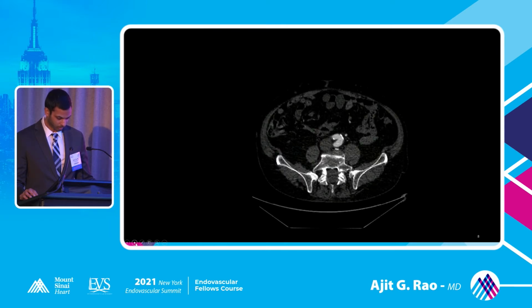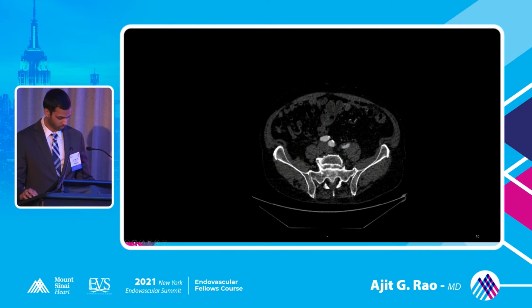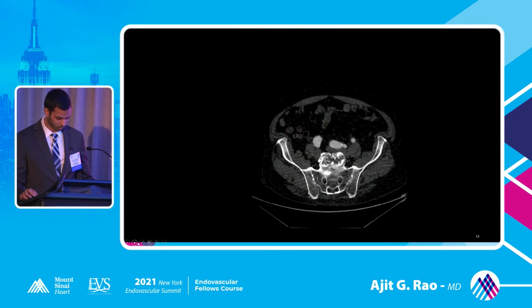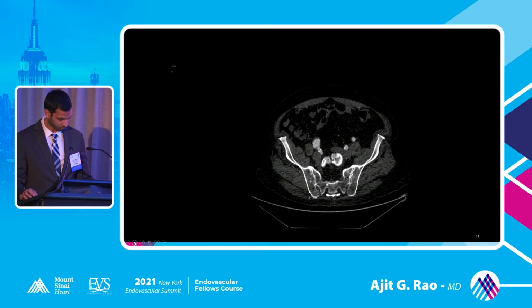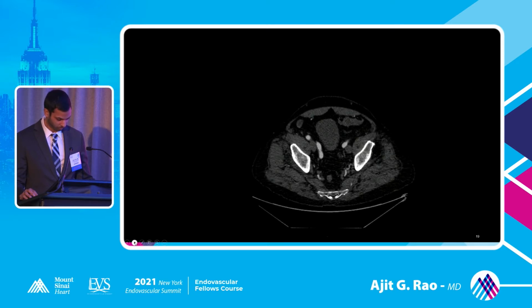And then going down, you see both iliacs. And so the first thing to note is his iliac arteries are very tortuous, right? So trying to go up and over on this case would be very challenging. As you go down, you'll see that there's multiple bends, and especially in the setting of that small aneurysm there.